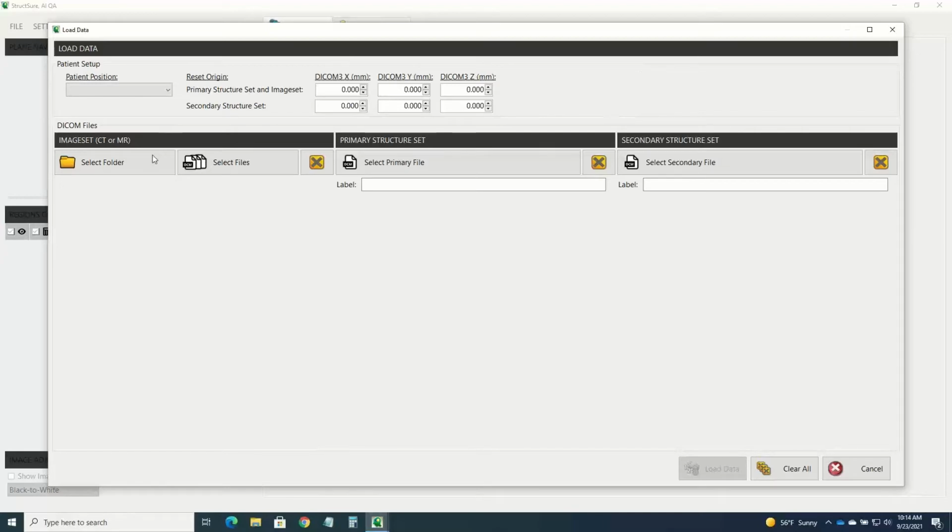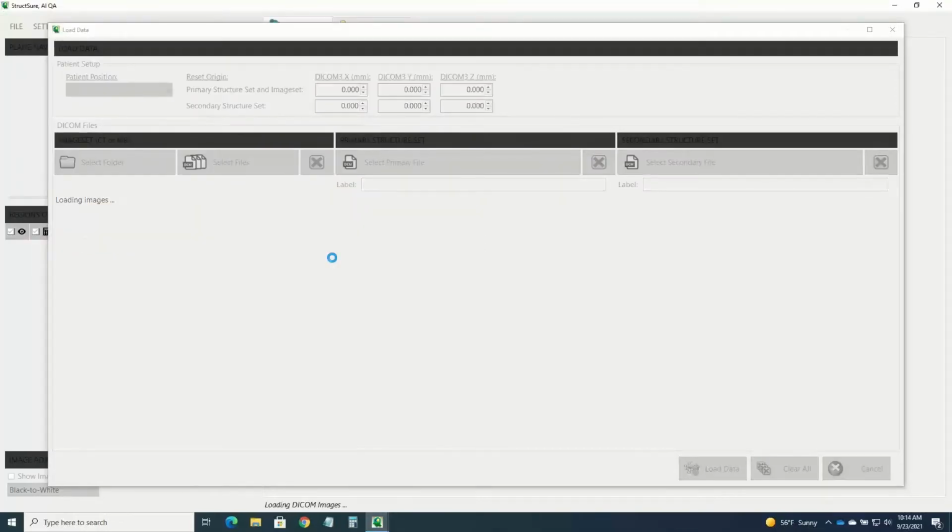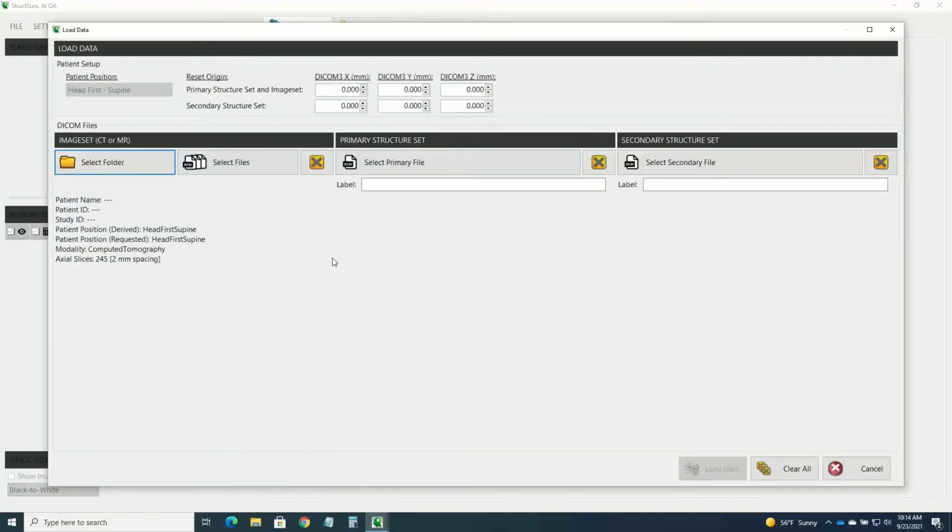The first thing you want to do is open this up and grab some CT images. We grab that and it's loading them. I want to apologize offhand, this will be a little bit slow. I'm doing this from a different computer, an older one, and it doesn't have the horsepower of the one I usually demo this on. But anyway, there it is.